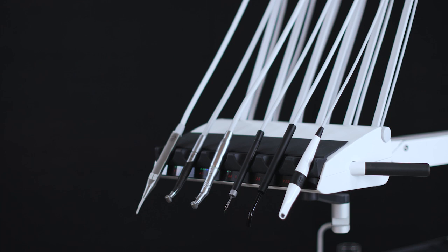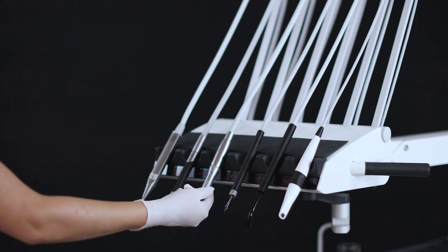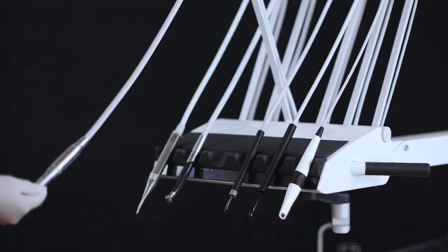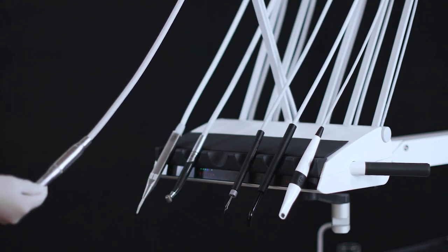When all unit instruments are at rest, the foot control manages functions related to the unit and chair. When a unit instrument is lifted forward, the foot control manages the active instrument.